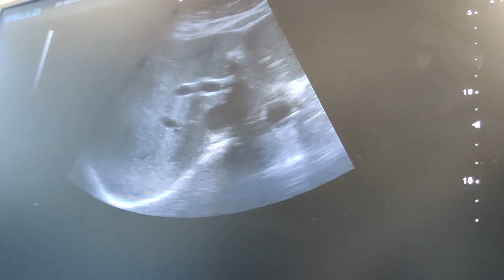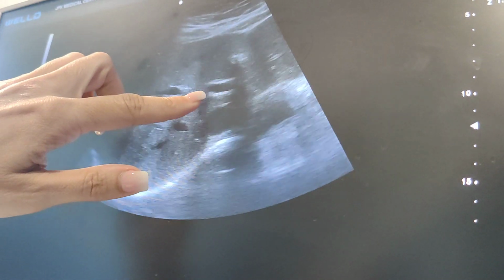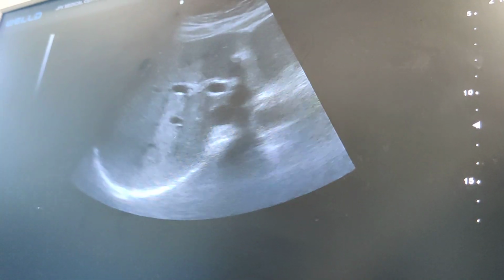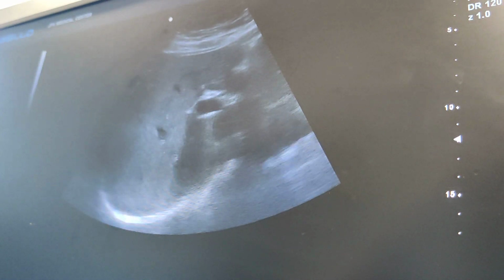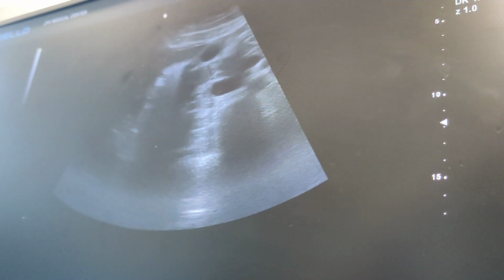And if I keep coming down, I'm getting into right lobe, and we see here the main portal vein, hepatic artery, and breathe. And big deep breath. Again, I do the same thing. I just sweep through the right lobe.